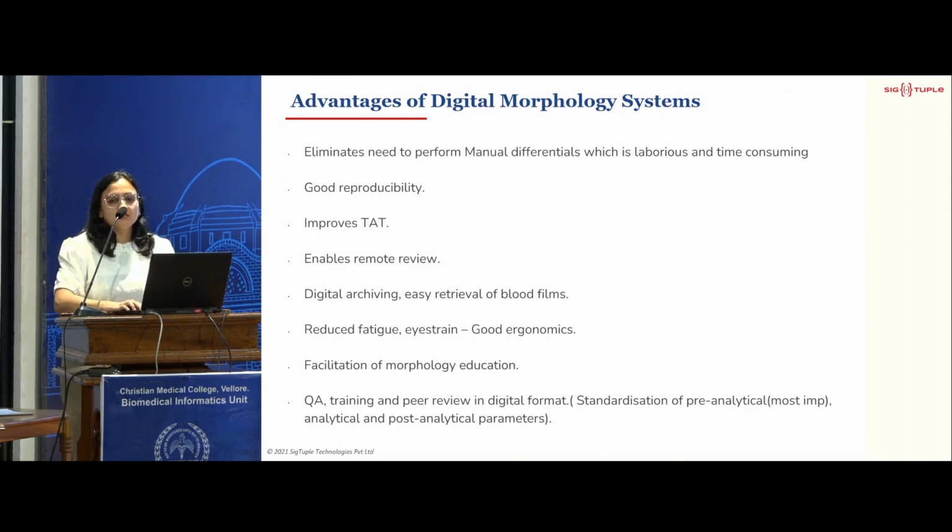So what are the advantages? I'll just reiterate them. It eliminates the need to perform manual differentials, which is laborious and time consuming. It has good reproducibility. It improves your turnaround time. It enables remote review, digital archiving, and easy retrieval of blood films. Like after 2-3 days, we usually discard all the peripheral smear slides. So here, your smear is stored on the cloud, on your cloud storage, okay? Reduced fatigue and eye strain, so good ergonomics. We're always sitting near the microscope. We might have spondylosis, we don't know, right?